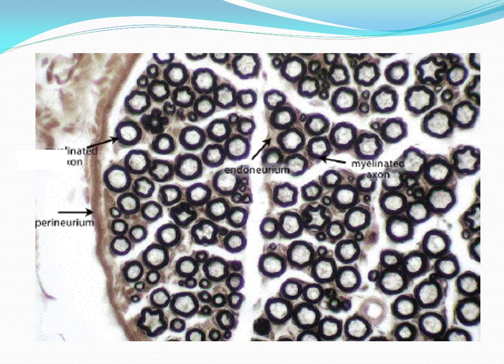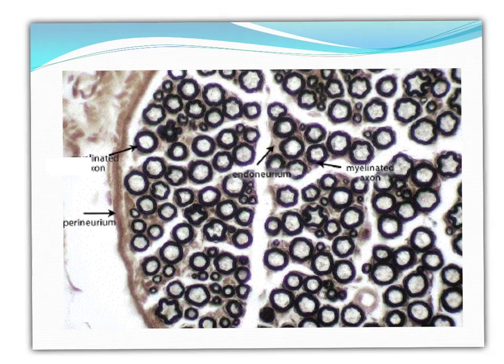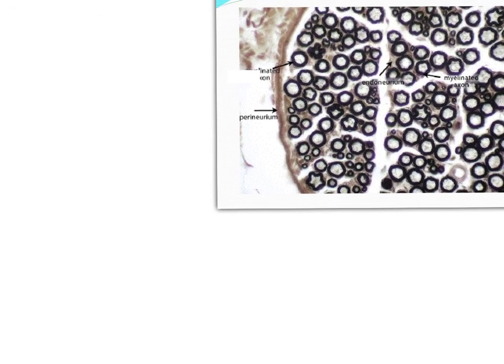In this slide, you may be asked about very important things about the myelin sheath. First of all, it is formed by what? Formed by the Schwann cells. How? By making several turns around the axon. So, this is as regards the myelin sheath in the peripheral nervous system. But in the central nervous system, it is formed by another cell, which is the oligodendroglia.